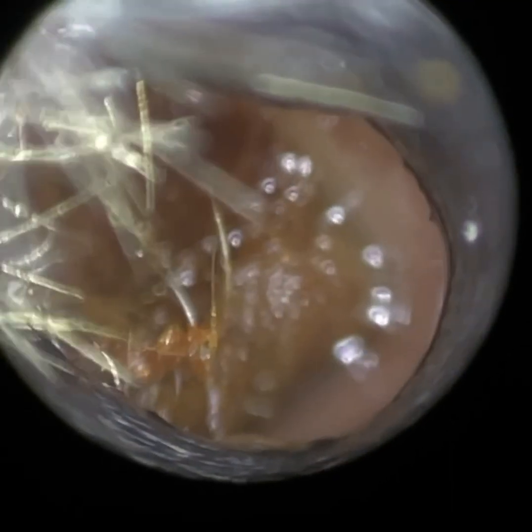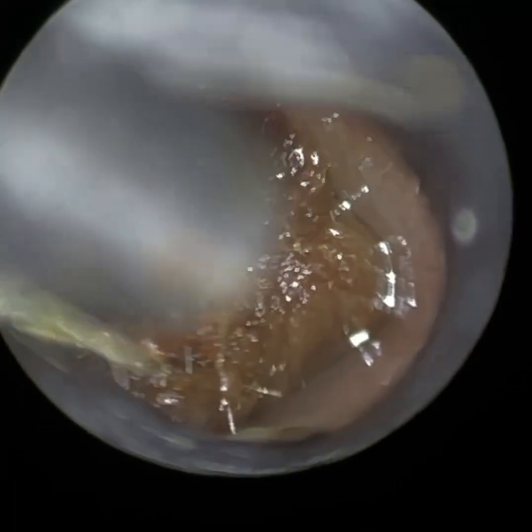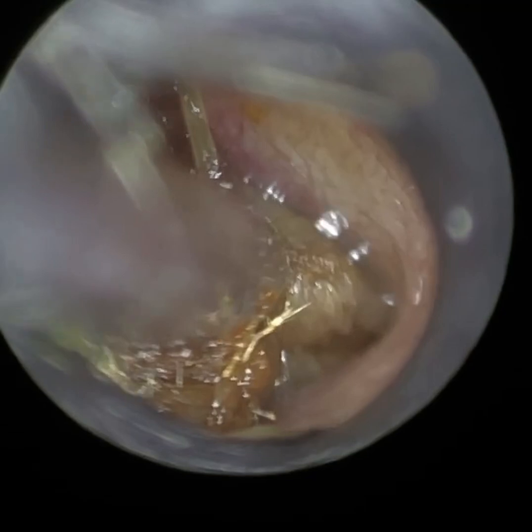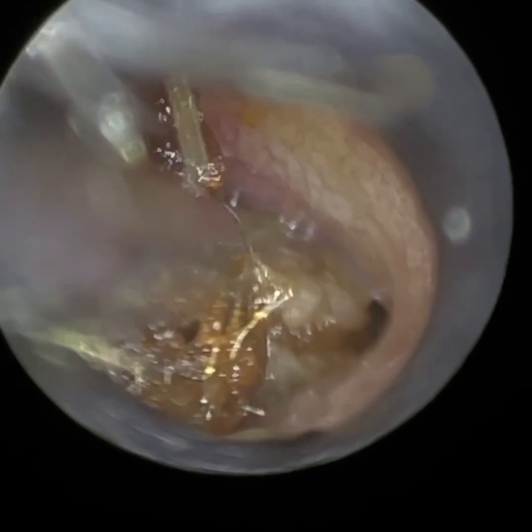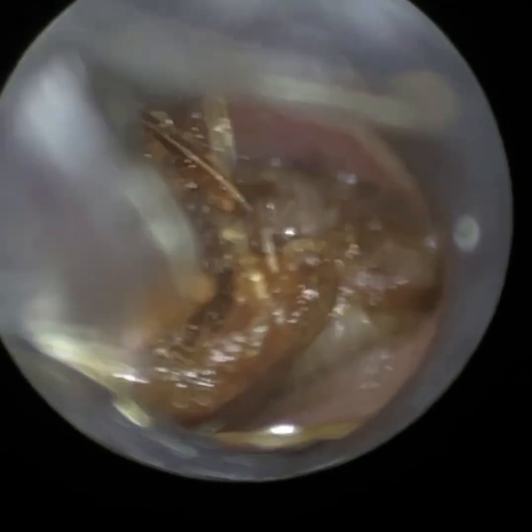And importantly, in terms of the Waxscope compared to similar devices on the market, the suction probe looks like a suction probe — it's not distorted and it's not taking away from the view. I'm just going quite deep in here. This bit of soft wax, you can see it's lodged beyond the isthmus, so we know that's up against the eardrum almost.